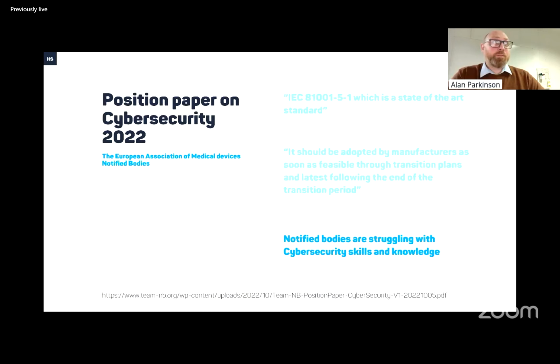What I have observed looking at a number of different approvals over the last 18 months is that the questions you get asked about cybersecurity from a notified body vary between the notified bodies, vary between countries, and vary between individuals within the same notified body. So you can get away with just doing the MDCG guidelines, or you're going to get asked questions and they'll want you to do 81001, which makes collecting what rules you do a little bit difficult.